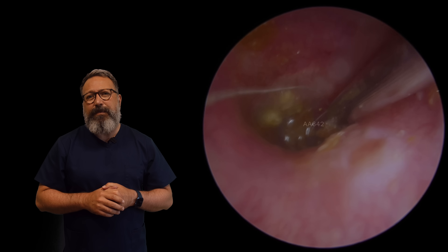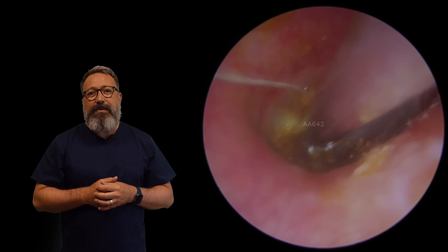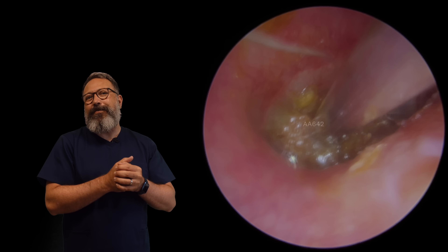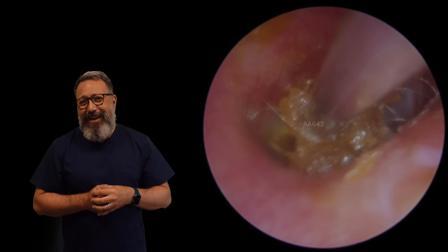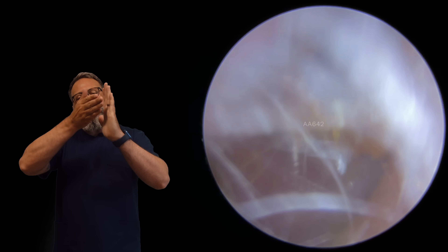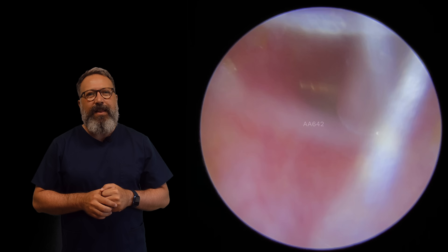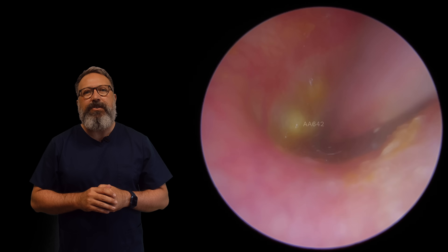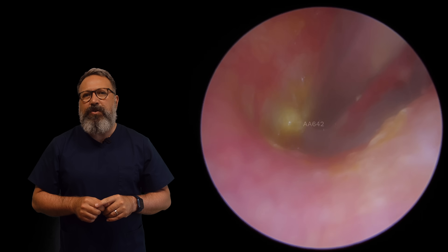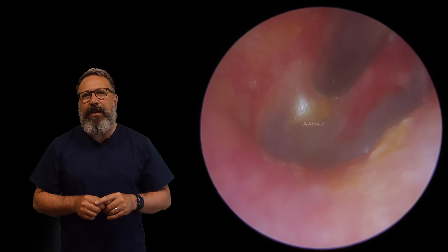Let's go back in and start getting a couple of these little loose pieces. By this point the patient can really hear a lot better. There's a little bit in the recess — you can see it just starting to lift. Up that comes out of the recess — look at what was hiding down in there. There's a long strip of dry skin that was hanging around in there, basically sandwiched from the eardrum over onto the canal wall. Let's lift that up and get it out. A little bit of olive oil in there just to ease these last couple of pieces along — very gently sneaking up to the last little bit. Two more pieces — let's get that bit to the left, grab that, and the last little bit just above it.